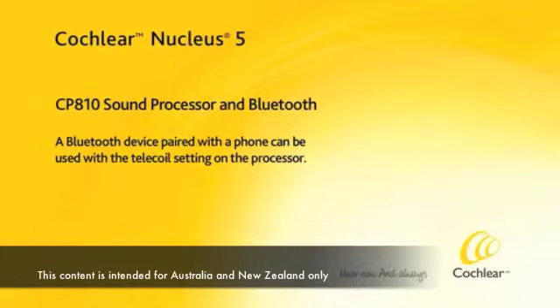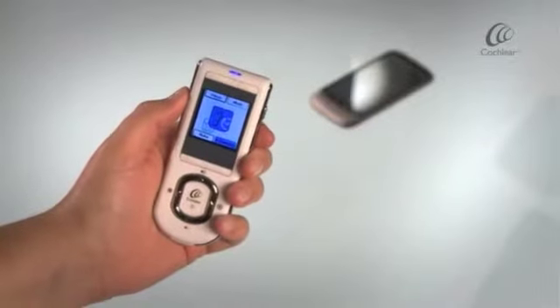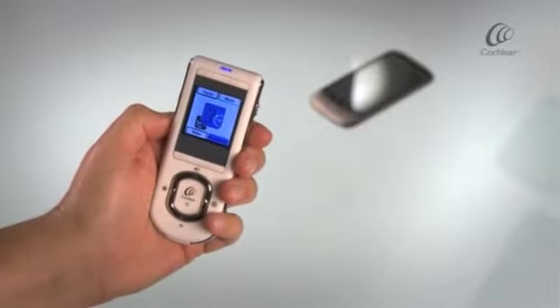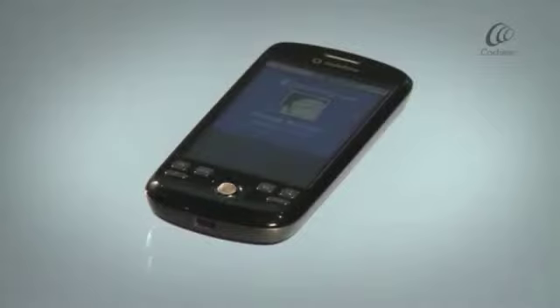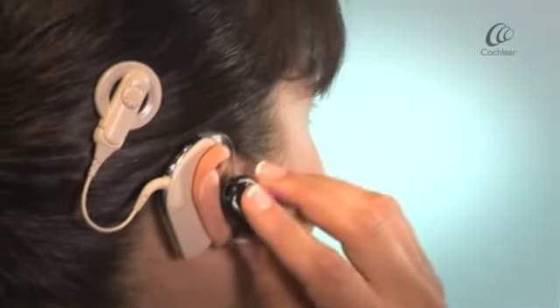A Bluetooth device paired with a phone can be used with the Telecoil setting on the processor. Activate the Telecoil and switch on your Bluetooth device. You will now be able to answer calls through the Bluetooth device attached to your ear.